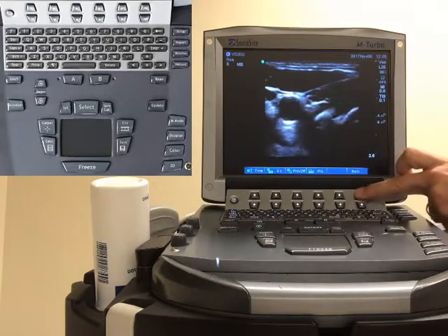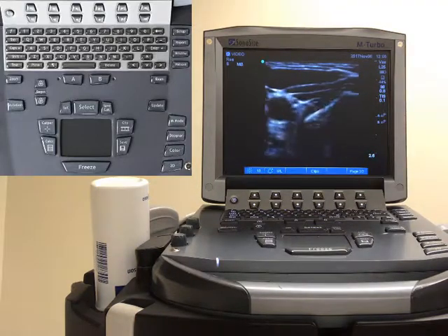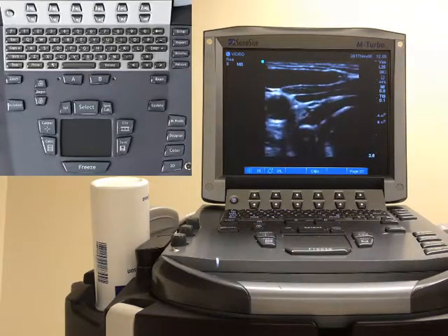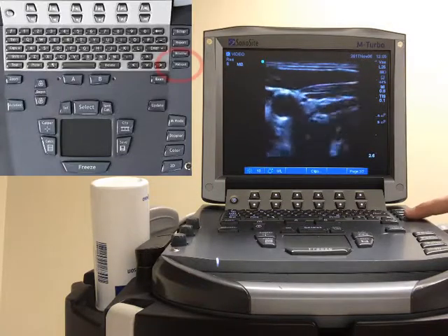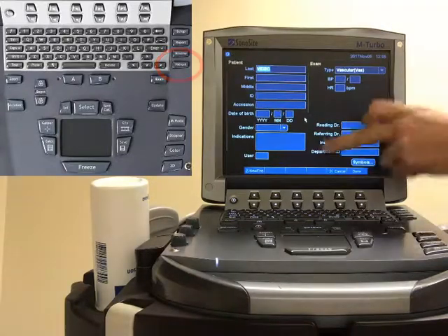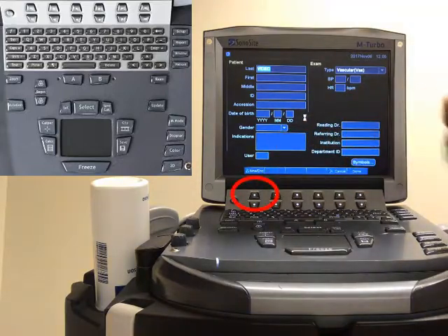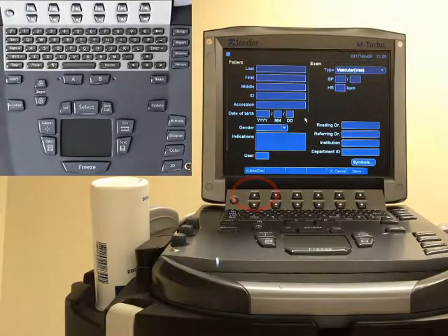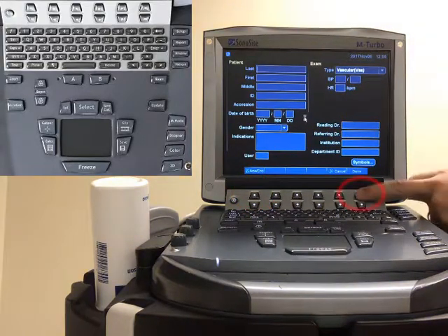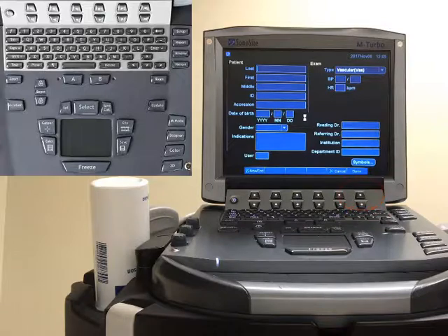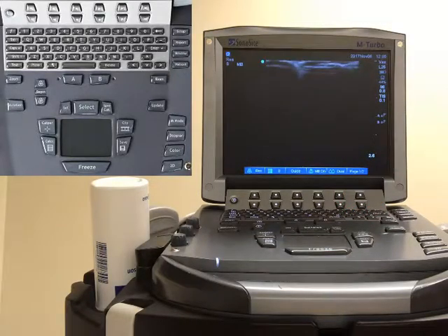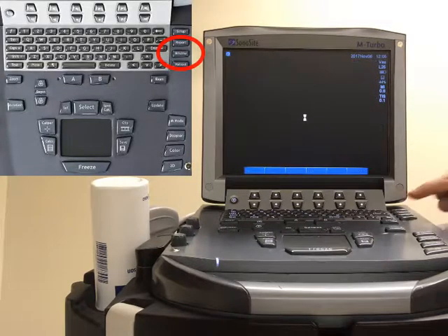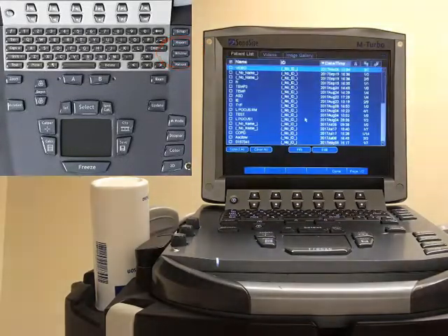Now that we have saved the images, in order to export them you should push the patient button again, end this study, and press done. To look at the bank of clips, push the review button and you will see the list.